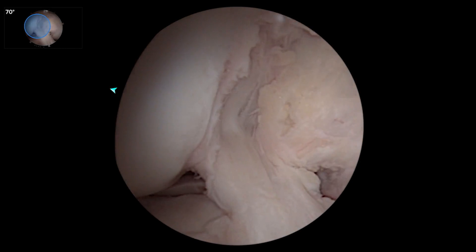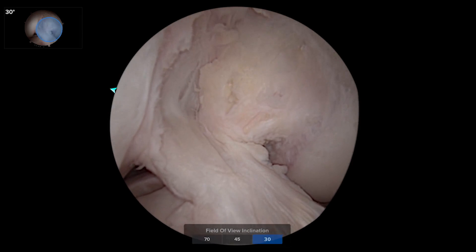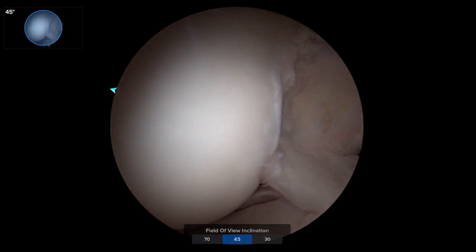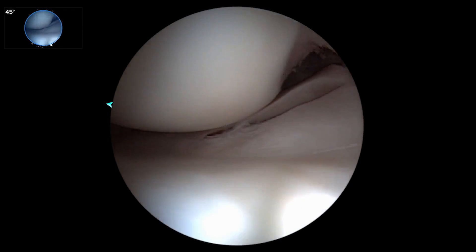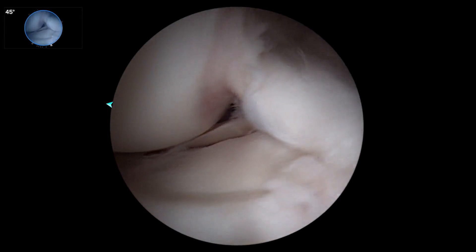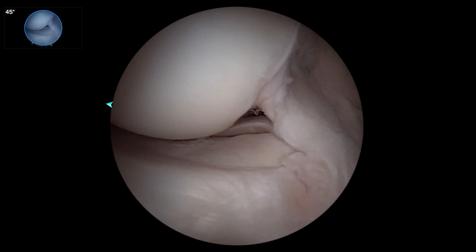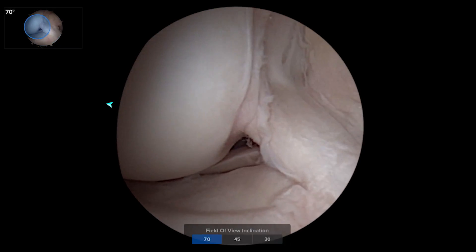If I just look at the notch and take it back to the usual 30 and then to this panoramic view, you can really get a good feel for the whole joint — great view of the whole lateral meniscus, the root, the ACL insertion — all those things we'd have to struggle to get around with just your typical 30-degree scope.